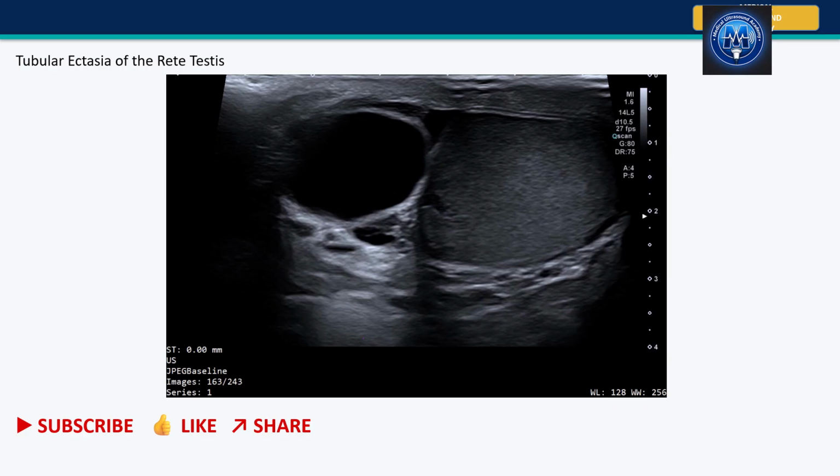You can see there's a difference between the normal type of hydrocele that you know and this type, because under normal circumstances, the hydrocele spreads in the scrotum around the testicle, with the fluid around it. But this is a cyst that you can see here. So this type of cyst is now mimicking an epididymal head cyst, but it's a specialized type of hydrocele which is only localized in the inguinal canal.